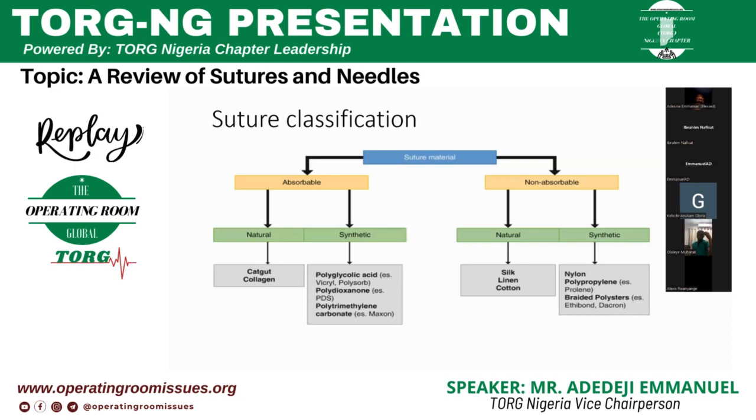however, the advantage that the synthetic absorbable suture has over the naturally occurring one, the chromic catgut, is this: catgut stays longer in the body, and most times it has been found that it has caused a reaction. A lot of patients come down with hypertrophic scar. Some come down with fibrosis, tissue fibrosis, and all of that. Some come down with adhesions.